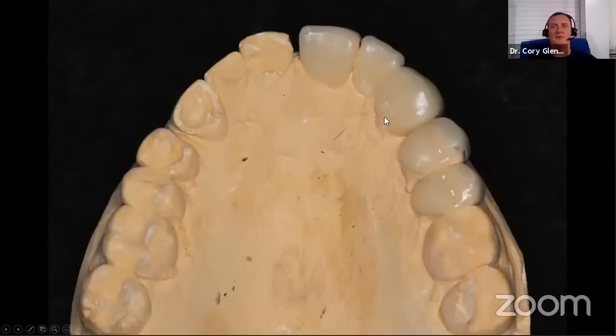And the result is that you would get a bunch of veneers. So I can pre-print those. Now I made these as the taco shell design where they cover buccal and lingual. They're easier to index. He's worn his lingual, so he needs lingual coverage as well, but I'm not touching the contact of the tooth, which is preserving a lot of tooth structure. So this guy, hypothetically, if I was doing this case, comes in, we don't even touch a burr to his tooth. Maybe we use a sandblaster and just clean his tooth real well with pumice. We etch them, bond them. The restorations are tried in, and then we just bond them into place with the veneer cement.